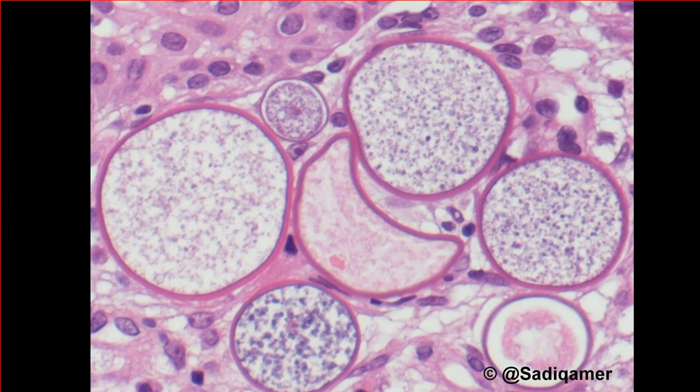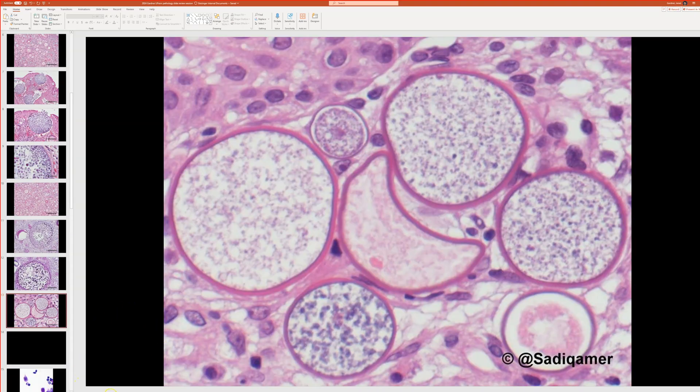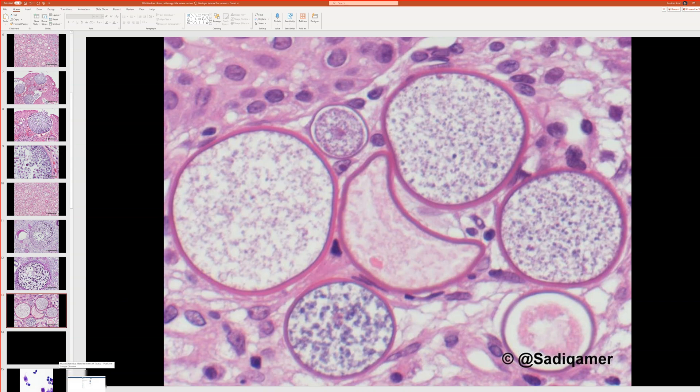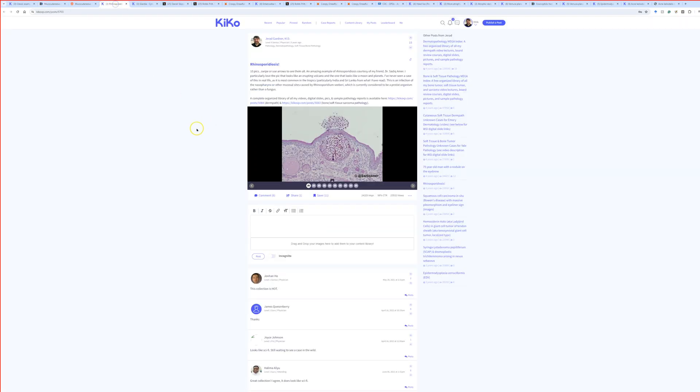Rhinosporidiosis? Yes, very good, rhinosporidiosis, excellent work. And again, something I've not seen in my practice, so that's because this is usually in the tropical parts of the world, particularly in India and Sri Lanka are the areas that it's well-known for, but I think it can occur in some other tropical regions.